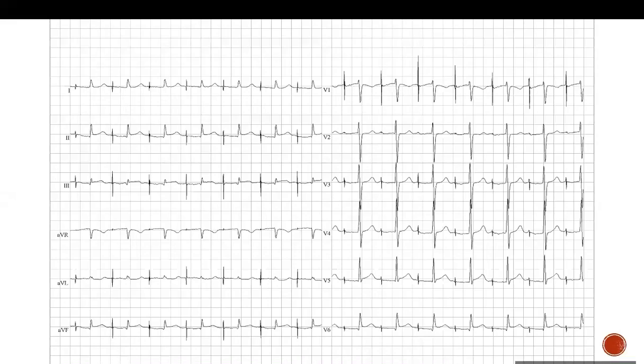So, is this a single chamber device or a dual chamber device? I think most likely it's a single. There is no ventricular pacing. As we said, absence of evidence doesn't mean evidence of absence. Yes, I know. But it's actually more likely to be dual than single, because you're seeing atrial activity. You don't see any ventricular activity or at least any pacer. But you could have a ventricular lead that is sensing the ventricle and inhibiting pacing. Right or not? Yes, sure.